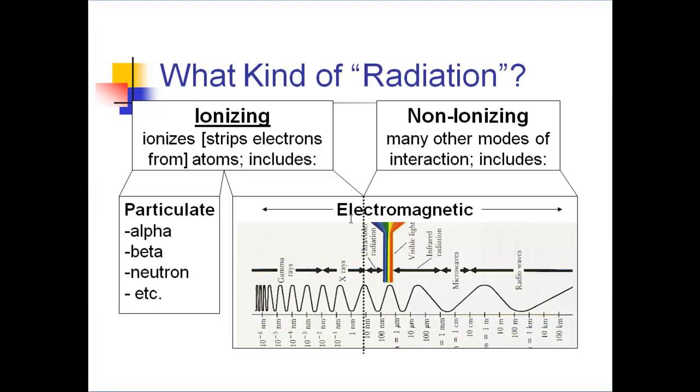The kind of radiation that we're talking about when using the DXA, which stands for Dual Energy X-ray Absorptiometry. So the name implies that X-rays are used, and X-rays occupy the ionizing radiation side of the electromagnetic spectrum from about 0.01 nanometer wavelength to about 10 nanometer wavelength.